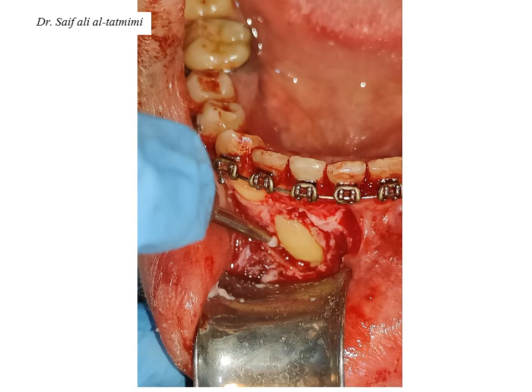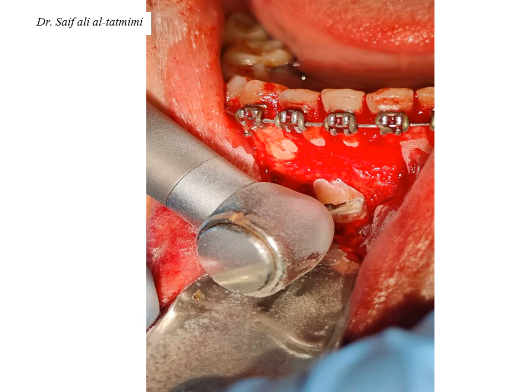After that, I'd like to do something called guttering using a surgical fissure bur. I create a space around the impacted tooth by going back and forth from mesial to distal on the buccal side of the tooth. This will create space for insertion of a straight elevator and also will give a space for luxation of the impacted tooth.